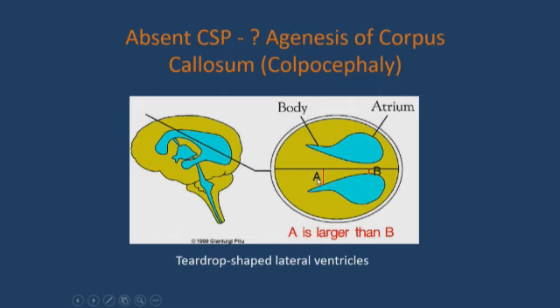Usually your anterior horns are right here, and then the posterior horns are back here. So if you can't see that cavum septum pellucidum, then start looking at the shape of your lateral ventricles, because this will help you. How far away is that anterior horn of the lateral ventricle from the posterior horn? The anterior horn should always be closer to the falx than the posterior horn is.